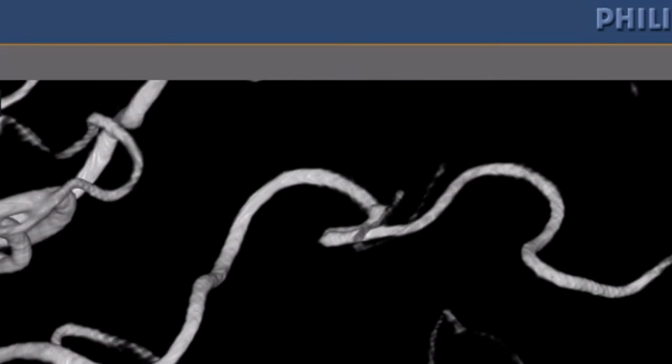Okay, the 3D on the right side is done. The wide neck aneurysm in the ophthalmic segment, and the paraclinoid is also wide neck. That's why we decided to place a pipeline shield on the right side, and the left side we will do next time. It's intradural, that's why we indicated the treatment. There are 3 aneurysms, it's multiple, and the patient is under local anesthesia.